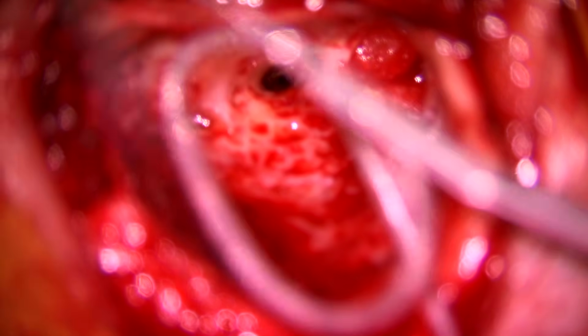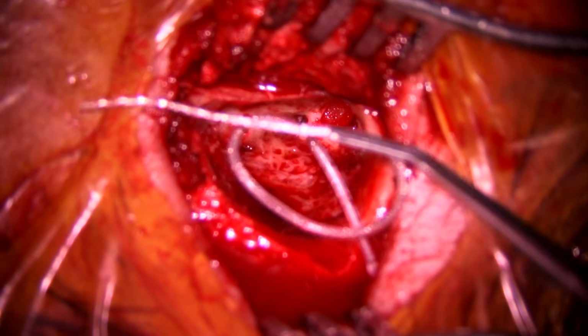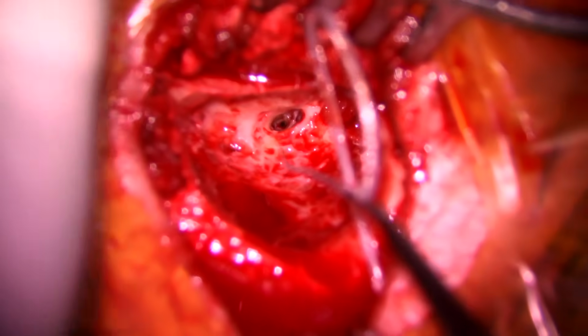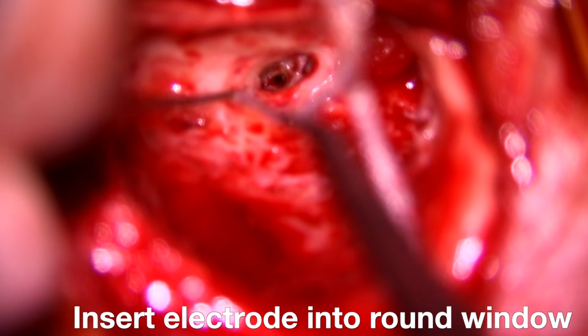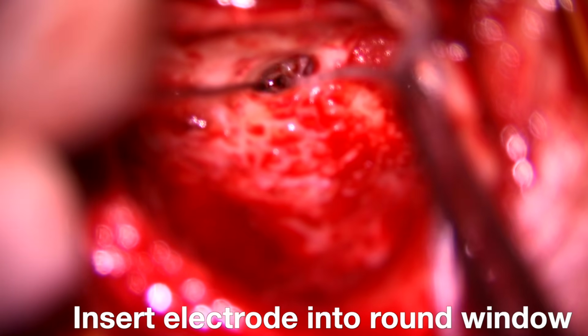This is a Med-El electrode, but as you heard from the description, most of them are similar in terms of how to place them. You can see it's a very thin, basically flexible noodle in this left ear. Superior is oriented to the right side of the screen, and so the surgeon has to grasp the electrode so that the gentle curve is pointing superiorly in line with the basal turn of the cochlea. On Med-El electrodes, remember that the dot goes at the top.